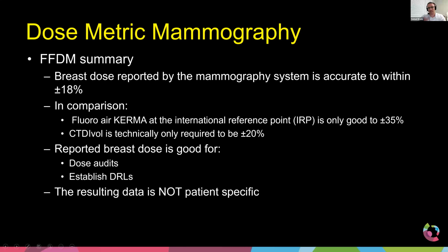We'll talk about diagnostic reference levels at the end of my second talk, but just put that in the back of your mind. It's probably helpful to collect all that data, and you'll have your national diagnostic reference level, but it would also be helpful statistics-wise, if you have enough statistics, to break it down by vendor type. We'll talk a little bit about other ways to break it down, but there is a little bit of variation from machine to machine to machine.